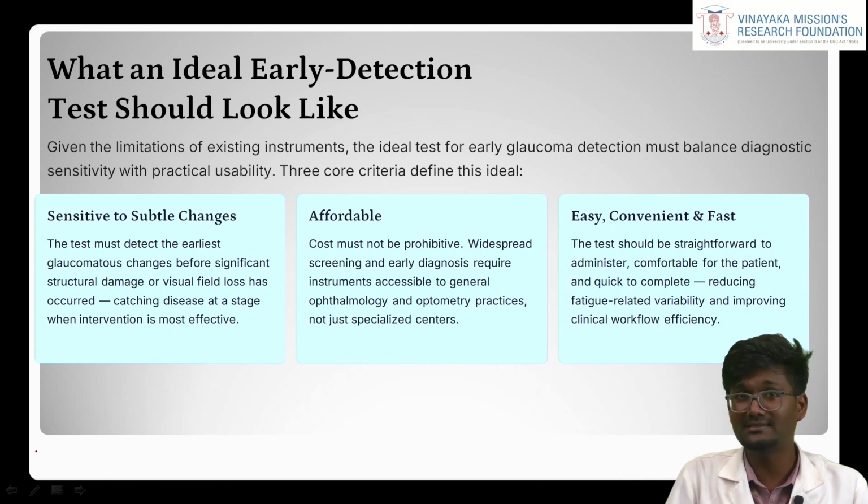In our day-to-day practice, we do confrontation as a screening tool, but some of the psychophysical instruments are also available as screening tools, which we see in the classes. The next requirement is that the test be easy, convenient and fast.